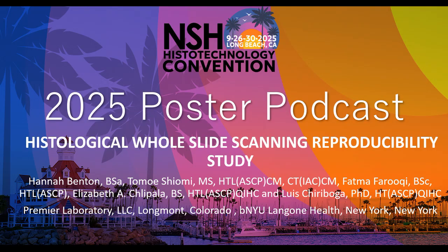On the H&E images, when we found the result based on the image analysis, we went back and looked at the actual H&Es and the images themselves, and you really have to work really hard to see those differences. It's not something we were looking at from the beginning to the end. So from a day-to-day perspective, you're not going to see that variation, right? It's only over a very long period of time, because we looked at the first cohort and the last cohort that we could actually visibly see the differences between the H&E images. It's not something that you're going to pick up every single day that you're scanning images.